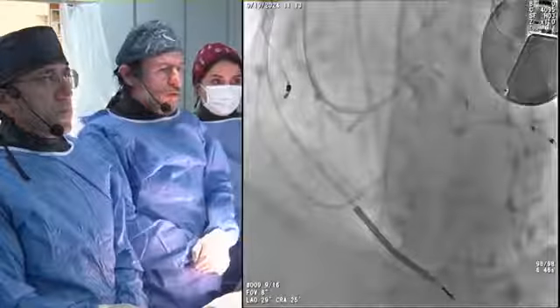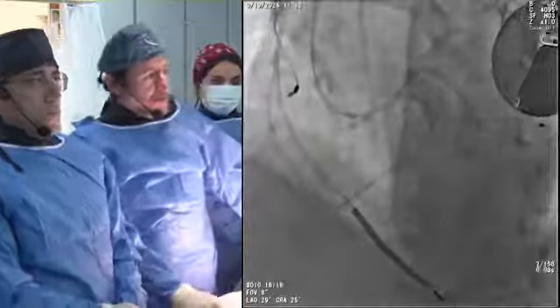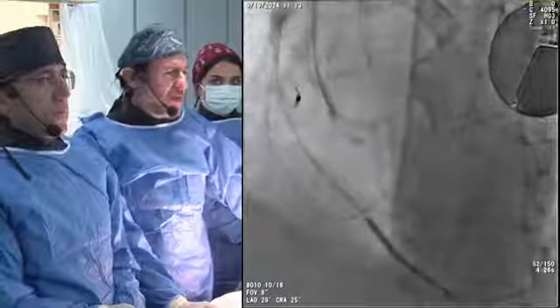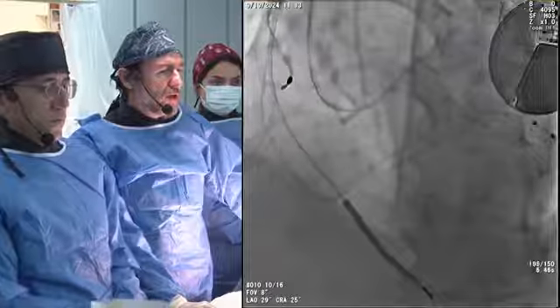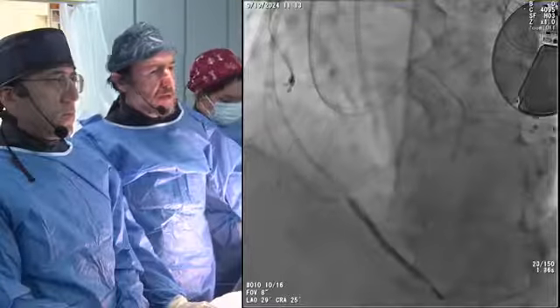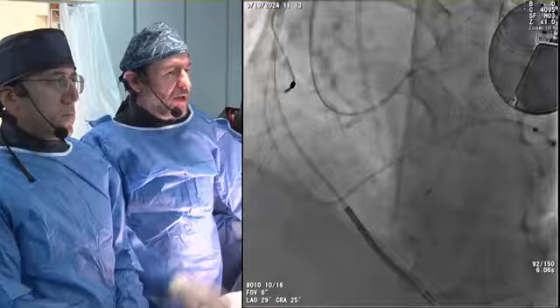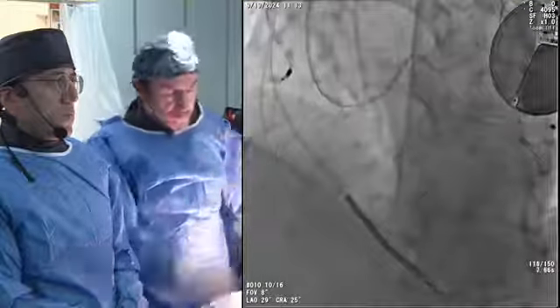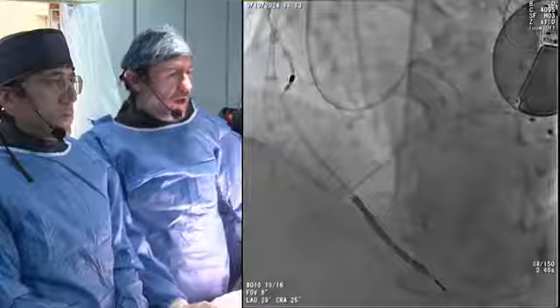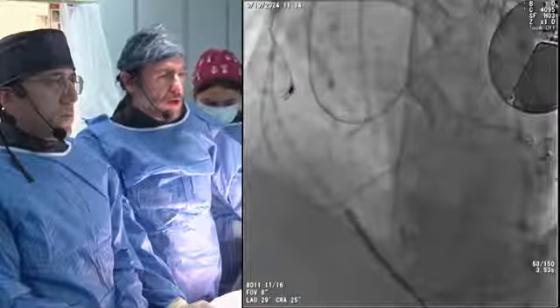And I want to show you how this microcatheter is advancing. The next one, please. This is a coiled microcatheter. It's like Corsair Pro, but it's a little bit different. It has a PTFE coverage in the proximal part, and the coaxial support is good for me. Maybe I haven't used it as much as Masaya Sensei uses the Corsair Pro, but I feel better with this one when I cross very tiny septals, and therefore this is now my default microcatheter.